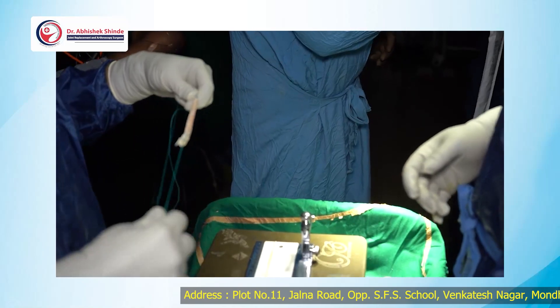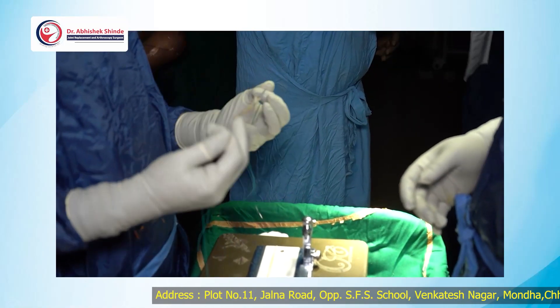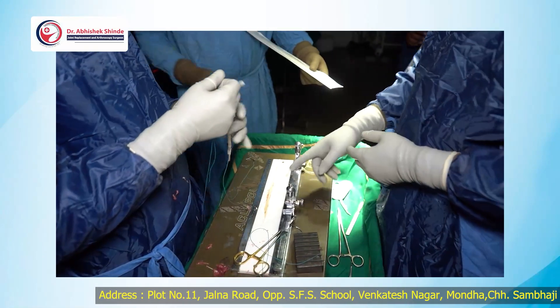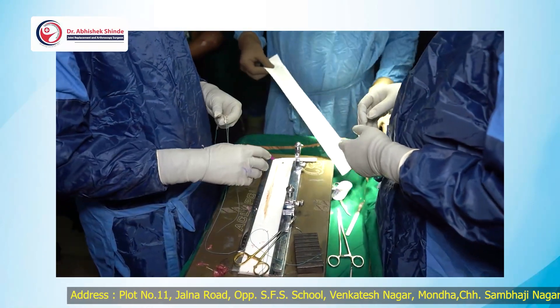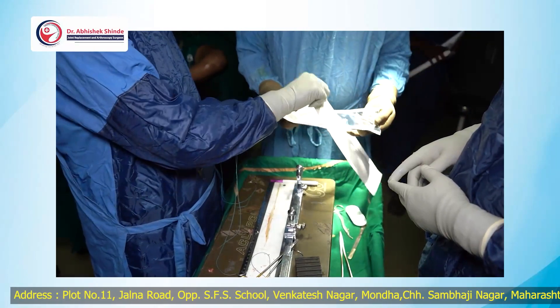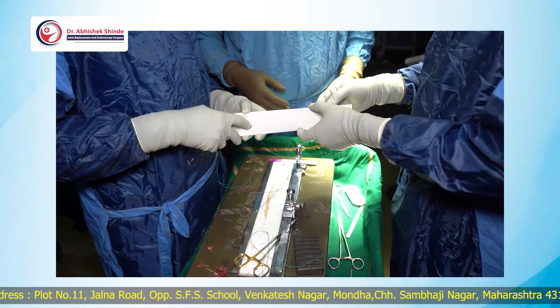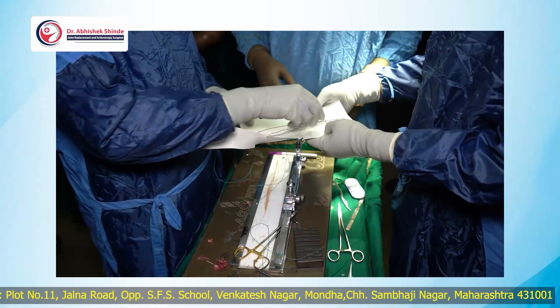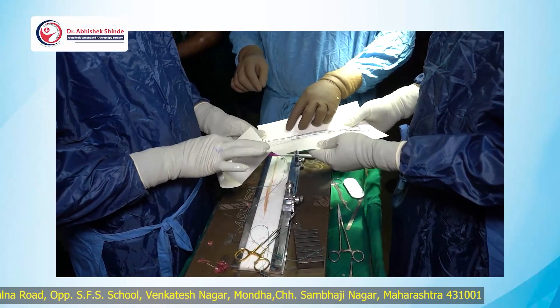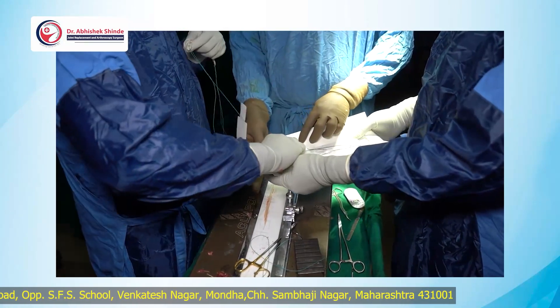For internal bracing, I prefer to use a fiber tape as well. This adjustable endo button is from Xeronics company, which is a very good company that we routinely use.